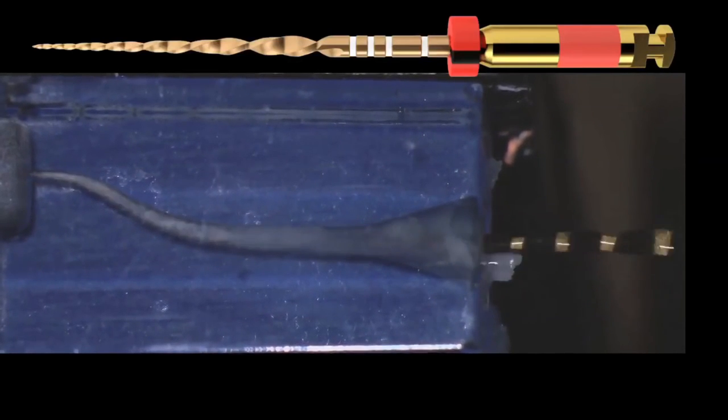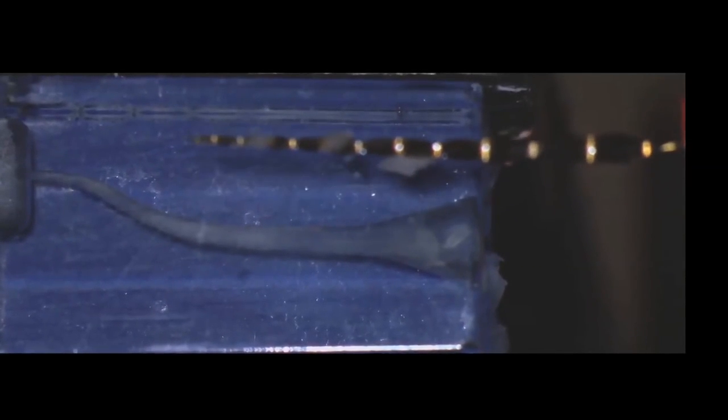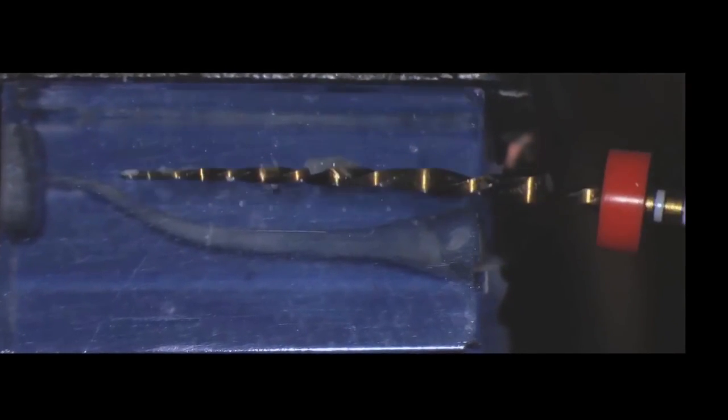As soon as we achieve that length, when the rubber stop touches the reference point, we don't need to continue reciprocating inside the canal. You can see the efficiency of this file in cutting dentinal chips. We clean the instrument. We will irrigate with the needle now as deep as we can.